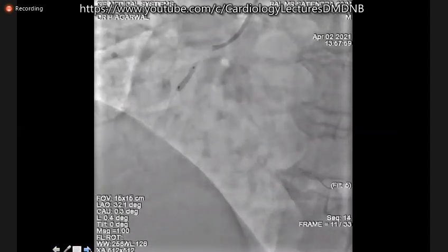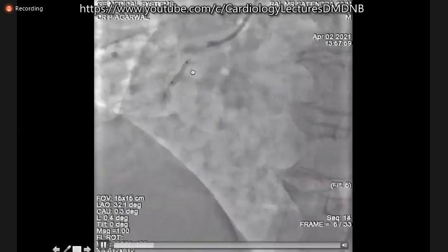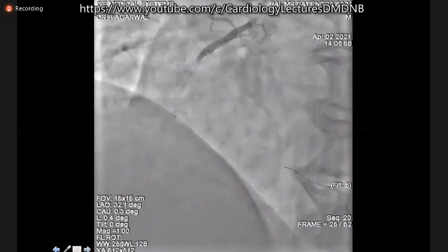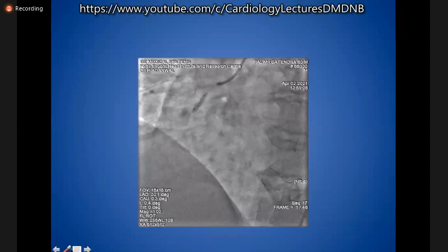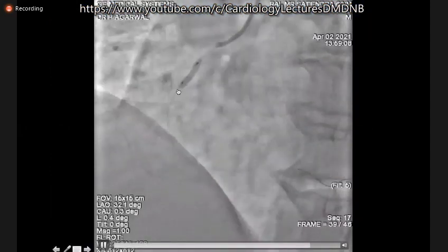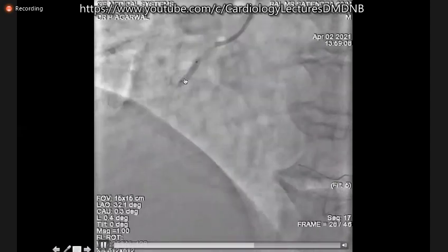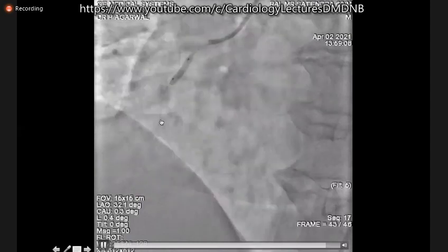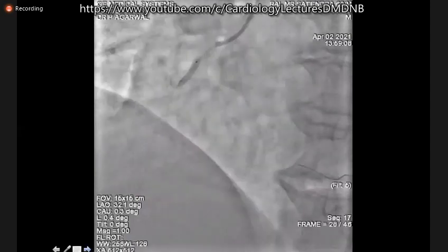Now see this one. This is the hardest point where the lesion is completely occluded. This is the cutting balloon at about, say, 12 atmospheres. It's not giving way. So you rotate the cutting balloon and see the next picture. Oh, sorry. Let me just go back. See this? It's completely open now. So now you know this cutting has made a good dent there, and the good cutting is there to just make my stent expand.